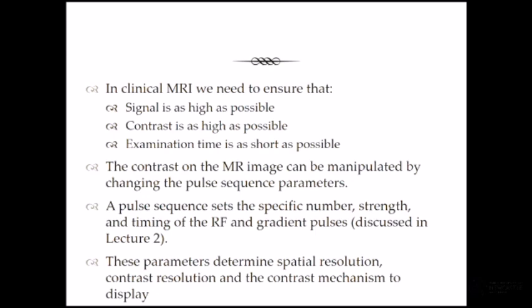Okay? Our contrast resolution is all about if we have two like structures side by side, but they're composed of different tissue types, being able to tell those two things apart. So that's our contrast resolution.